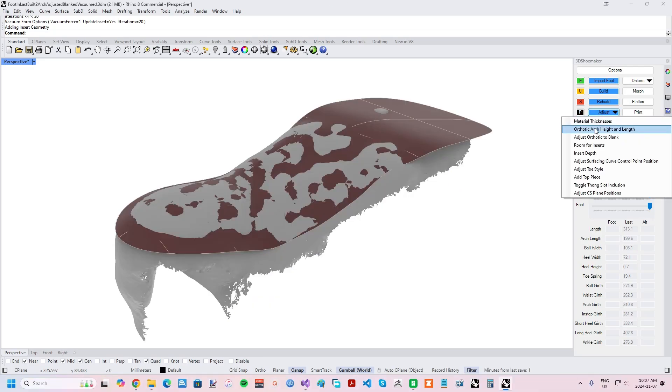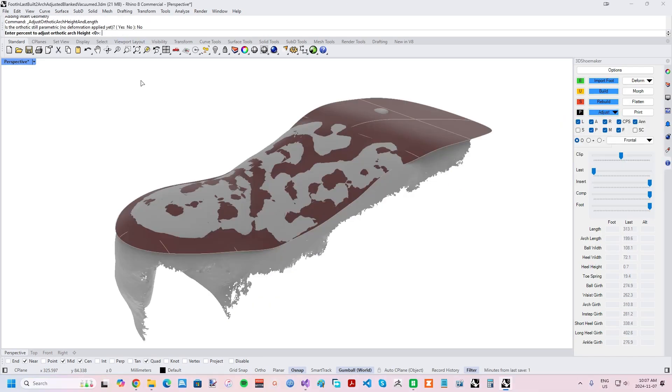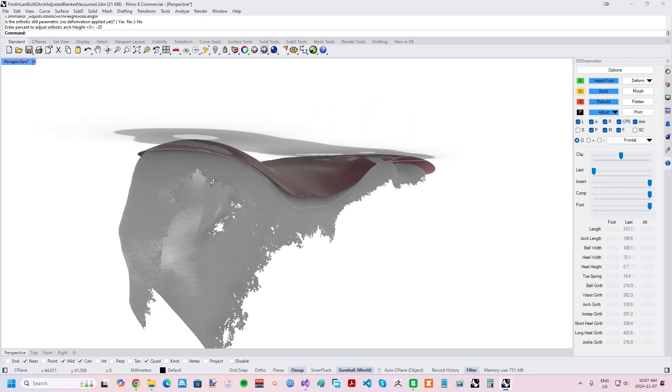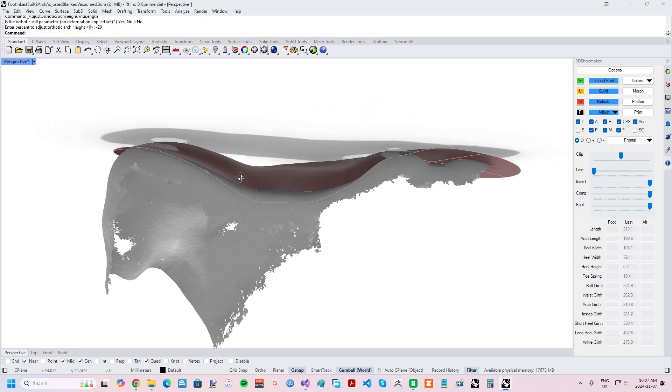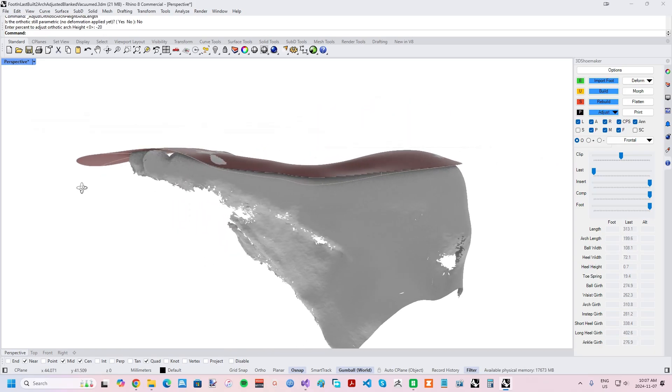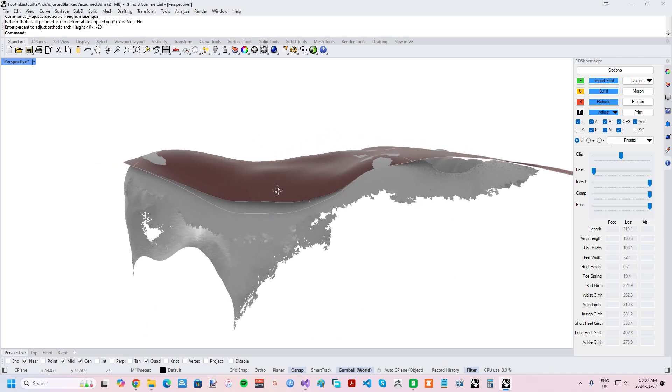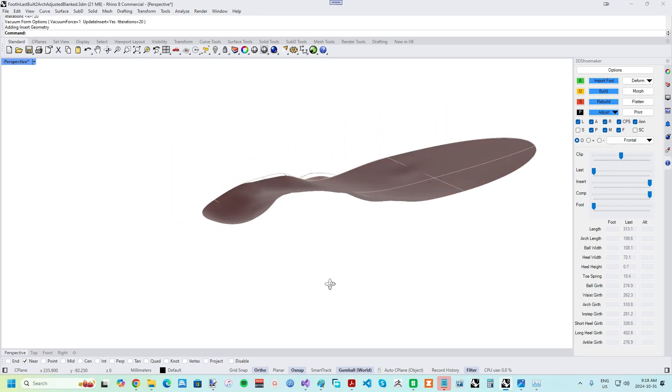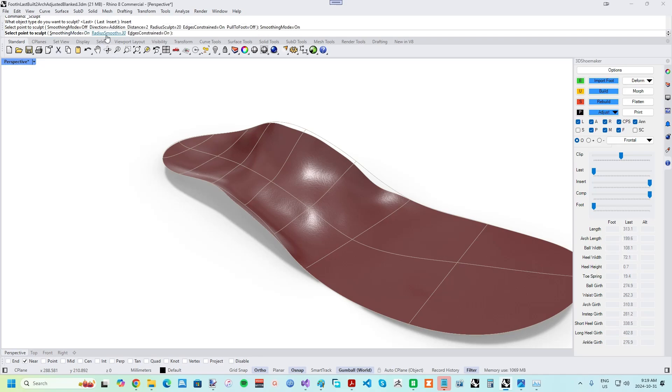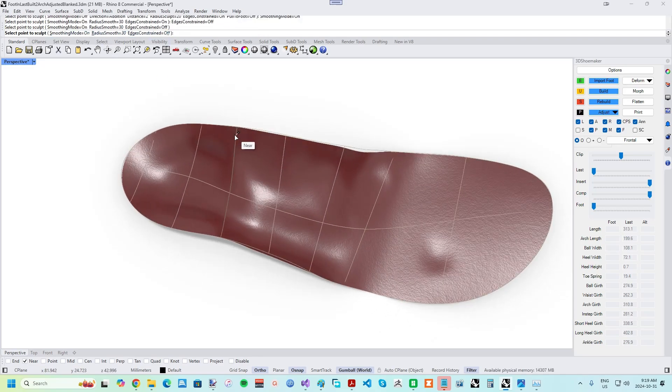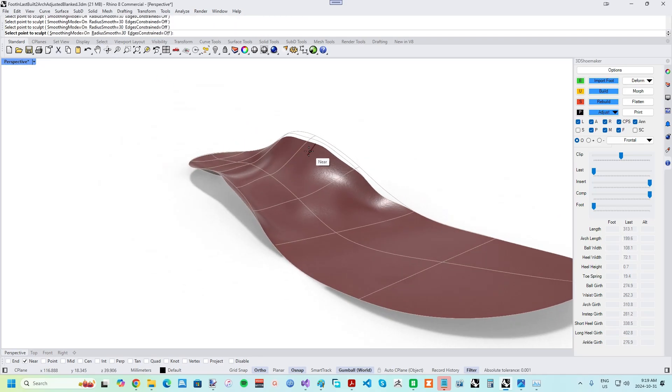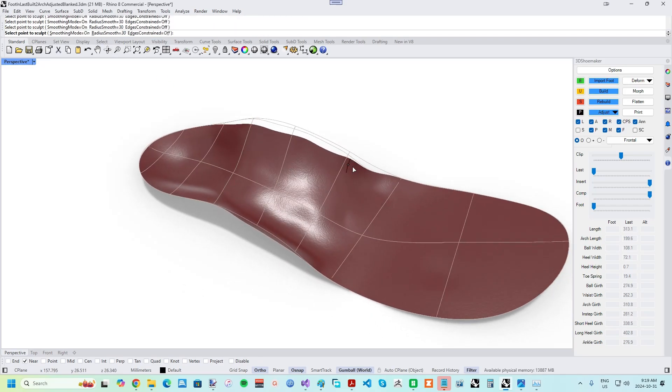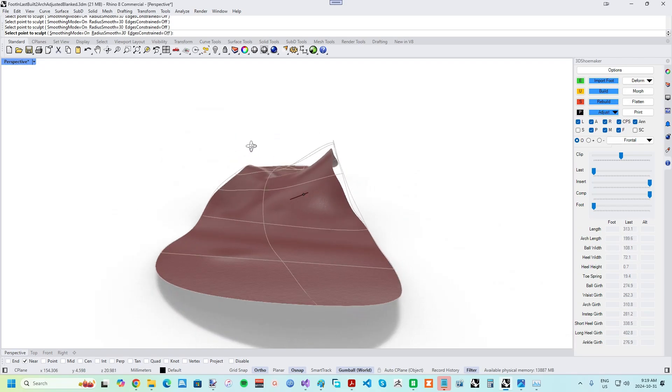The solution is to reduce the arch height via the Adjust Arch Height and Length function found in the Adjust drop-down. For instance, Vacuum Formed Arches can be adjusted by negative 20%. And then the sculpting tools can be used to achieve more subtle variations, similar to how a foot impression might be adjusted prior to plaster casting with traditional techniques.